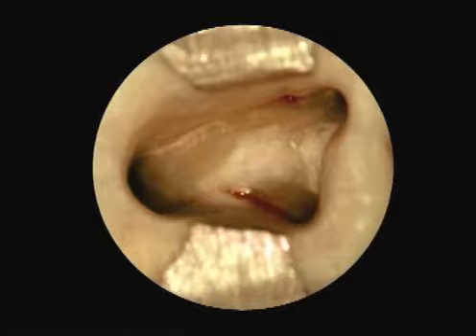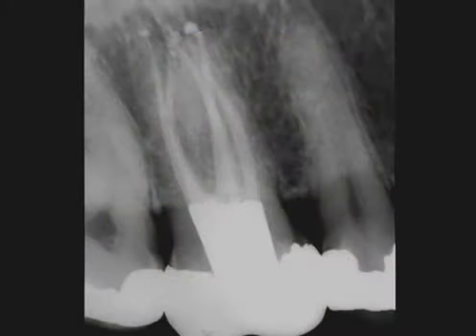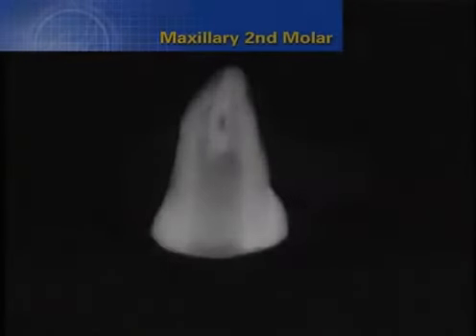With careful resection and identification and thorough cleaning and shaping, the post-op film reveals an MB1, MB2, DB1, and DB2, and a palatal system. Five systems in this maxillary first molar. Here's a straight-on radiographic view of a maxillary second molar. Notice that the roots are fairly short. In the distal view, it throws the buccal roots anterior, and notice how complicated the roots appear over length.